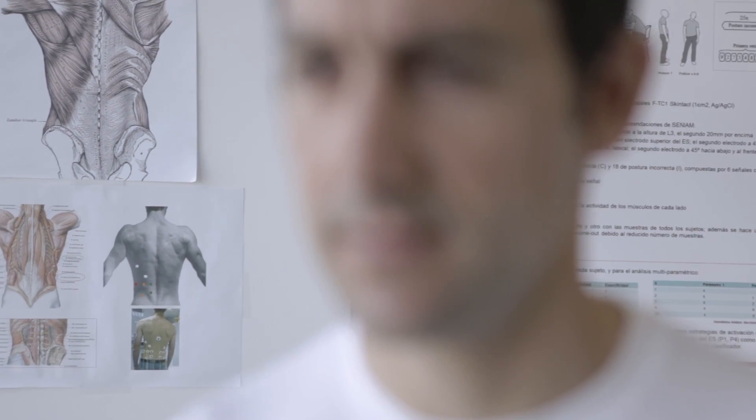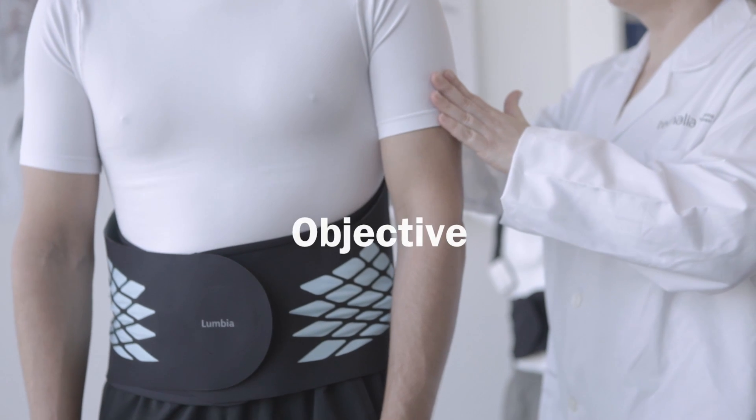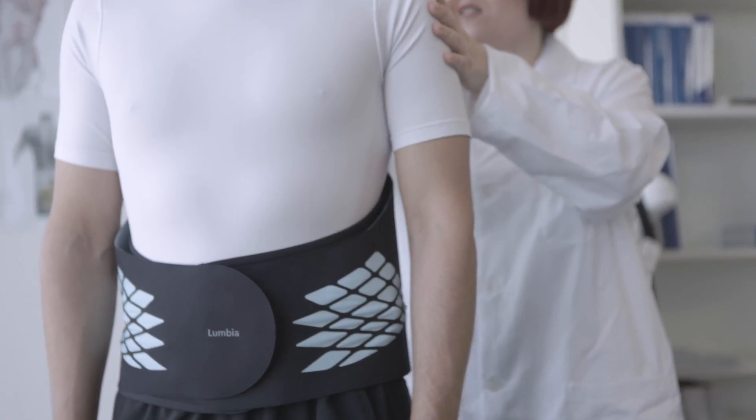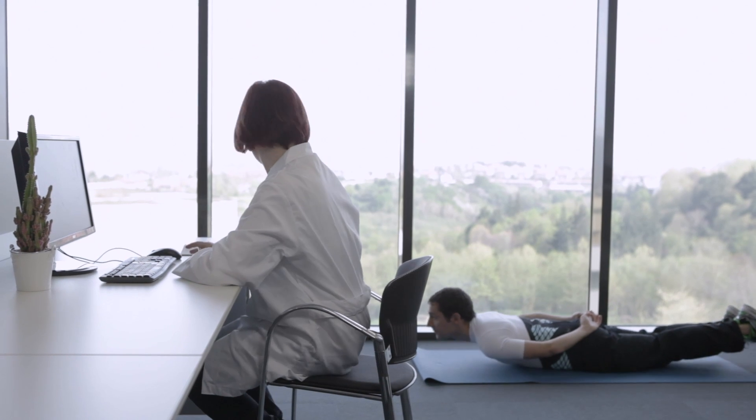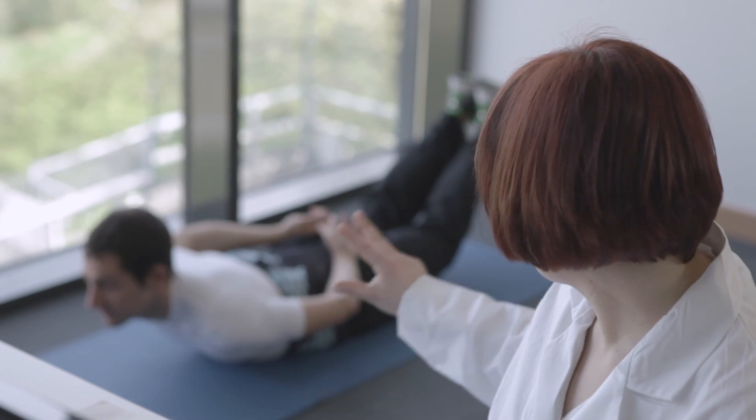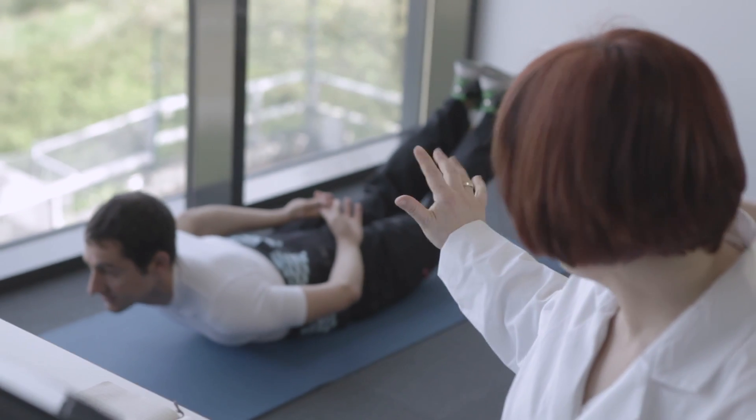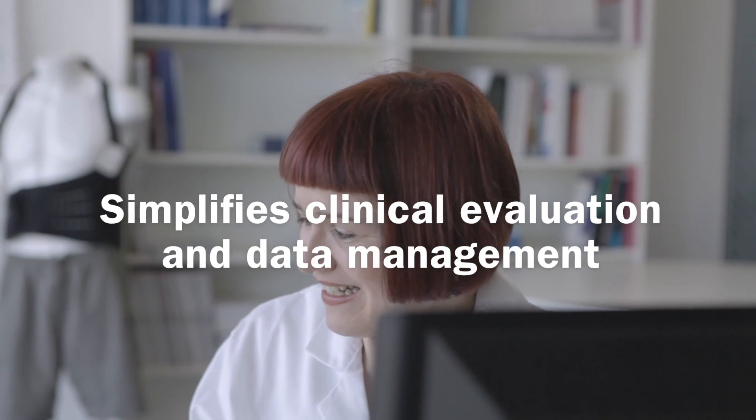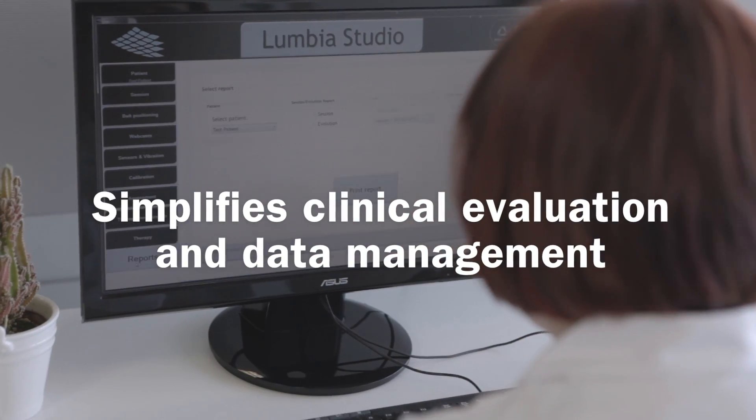Lumbia makes the patient's clinical evaluation more reliable, objective and less invasive throughout the rehabilitation process. Integrated test protocols, along with database handling capacities and on-spot vibro-tactile feedback, simplify the patient's clinical evaluation and management.